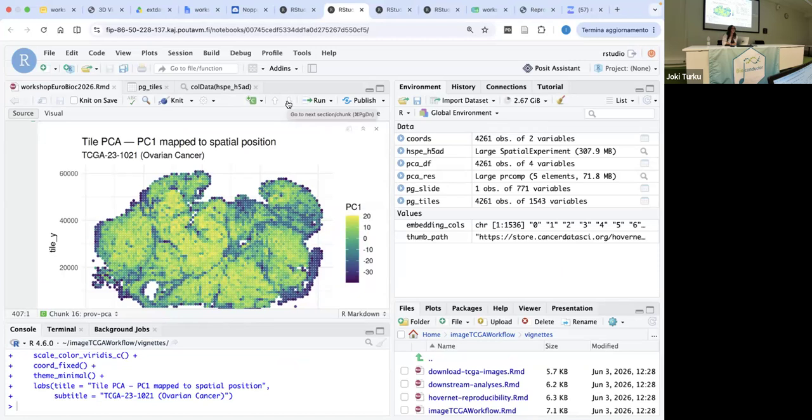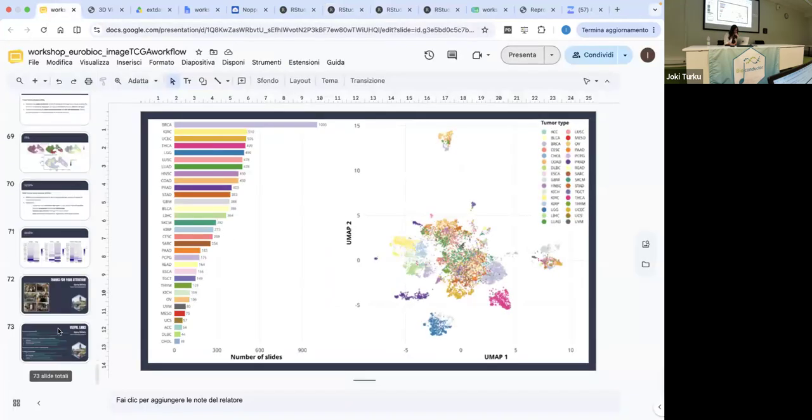Is there any advantage that is known just in benchmarking? In the future? Actually, there are a lot of foundation models right now for H&E images. Prov-GigaPath is just one of the examples. Other models are, for example, UNI, CONCH, or HistoPath. There are several ones. And for UNI, they made a benchmark on their GitHub repo. Maybe I'll add it in the final slide.